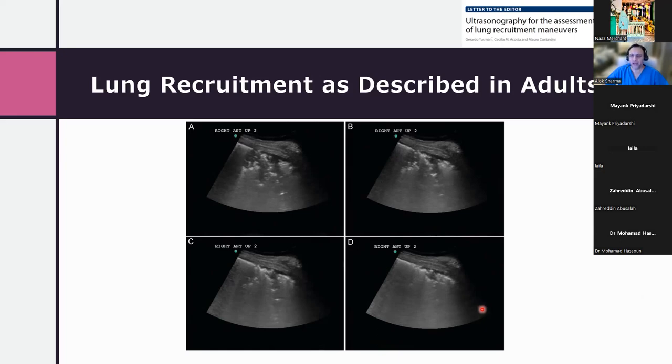Okay, that's really helpful. I'm keen to hear other opinions. We have a lot of experience in this group, over 100 years. So anybody else want to come in? Naz, you have your hand up. Just wanted to ask, going up by one PEEP at a time makes sense, but how long do you wait before you go up again?